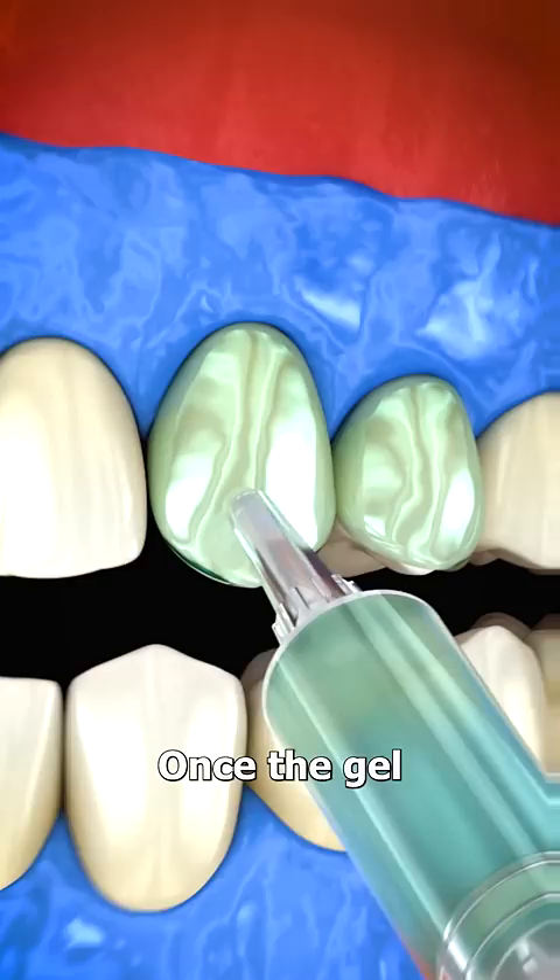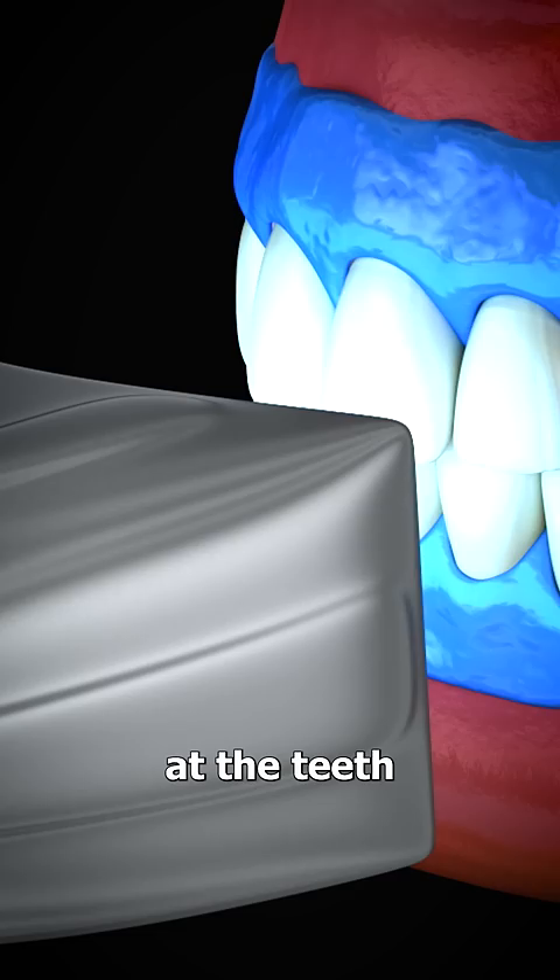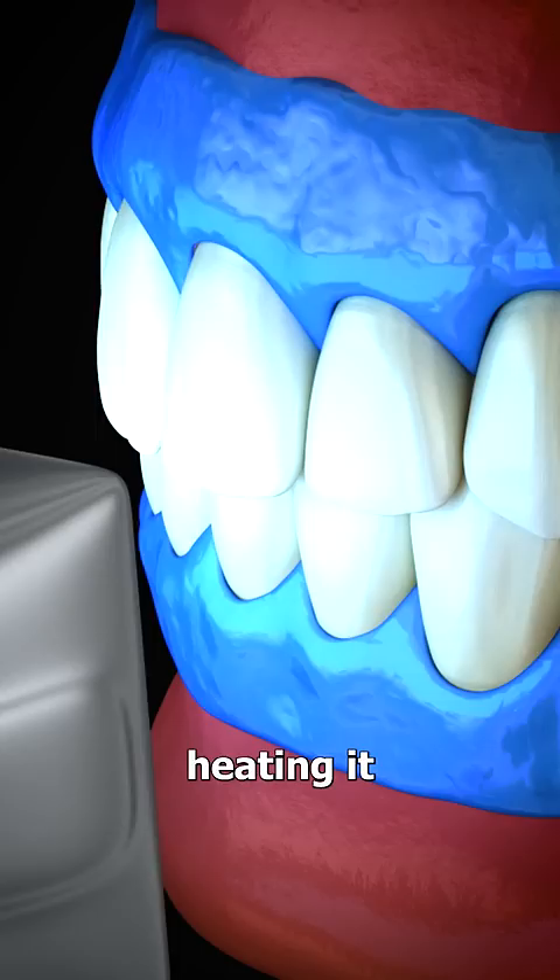Once the gel is on, a special light is directed at the teeth that activates the bleach by slightly heating it. This enhances the whitening process and allows the gel to penetrate the outer layer of the tooth, lifting away the stains.